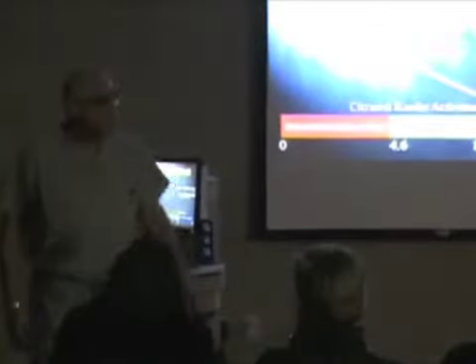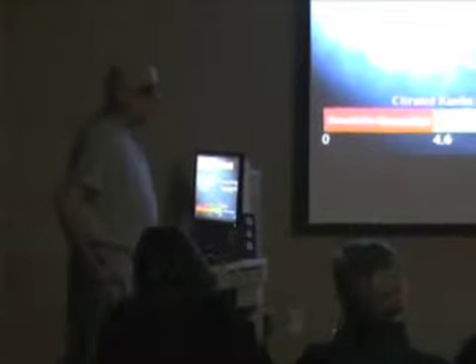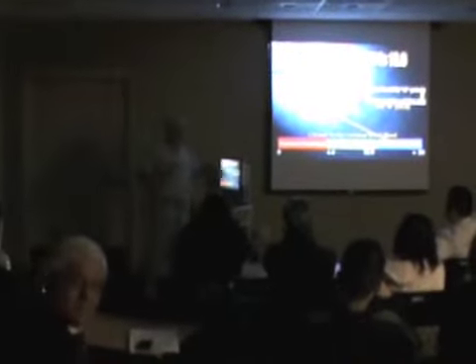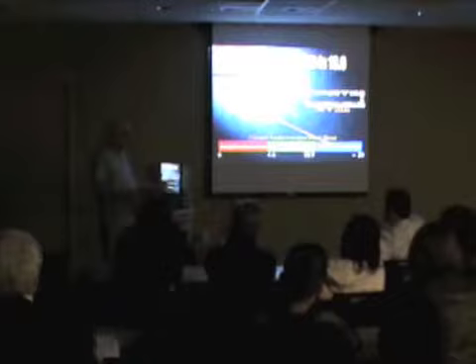TIA, aspirin, is aspirin enough? If they come in with a TIA, I run a TEG right away and see if the TIA is stemming from thrombin or from the platelet. If it's stemming from the platelet and you've got a G value greater than 16, aspirin is not going to be enough. So Dr. Hoyt, maybe we have to put a TEG in the stroke protocol as a test. Yeah, we have to put that in the protocol. Again, it's a way to assess. It gives you a window to see what's really going on with this patient.